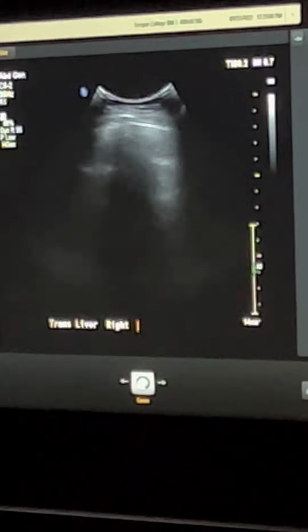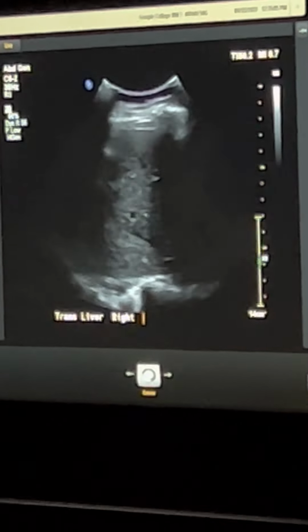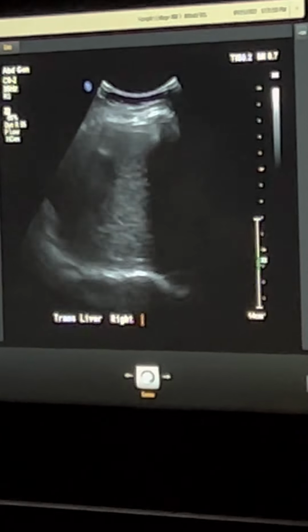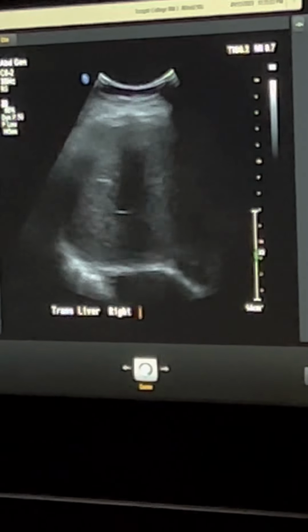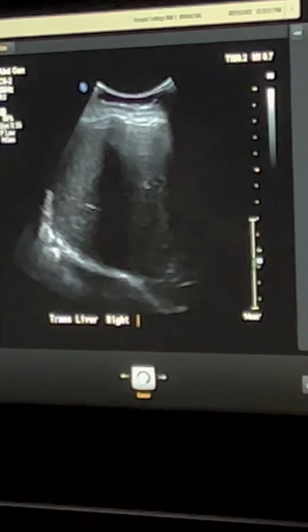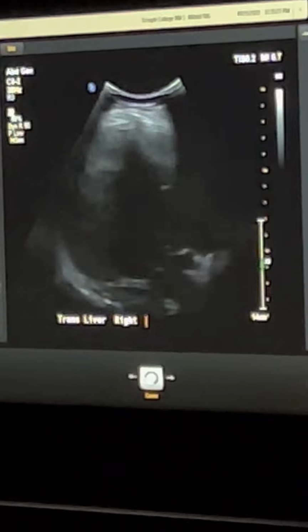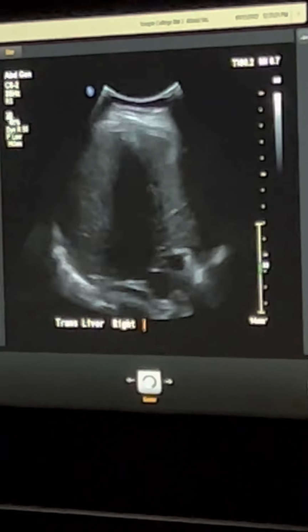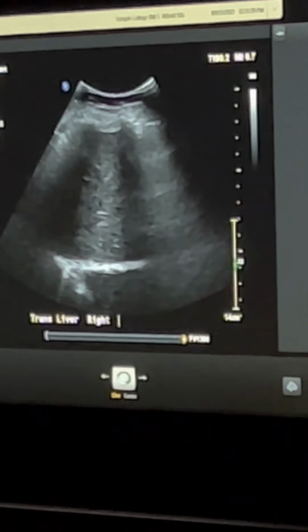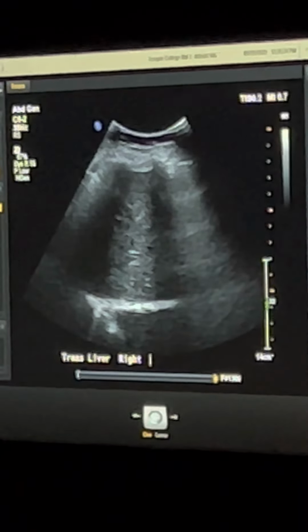So her superior intercostally, see how I'm having to kind of move around in the ribs and angle up through this space here. Your rib space is so tight. Okay, breathe. All right. So it's tricky getting in between her rib spaces because they're smaller together.